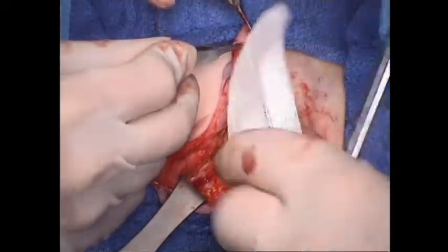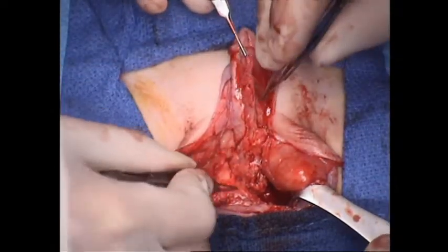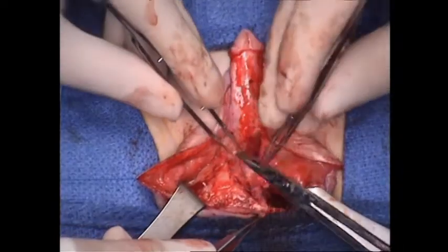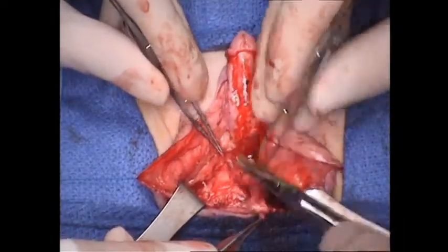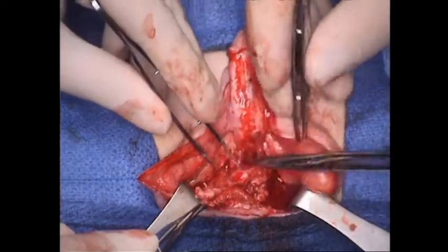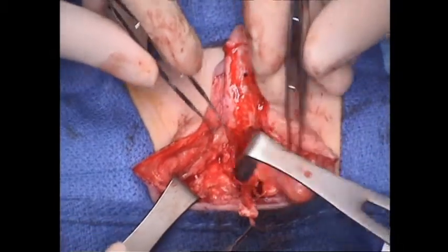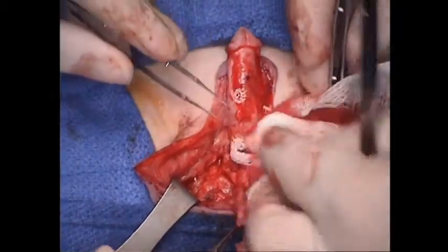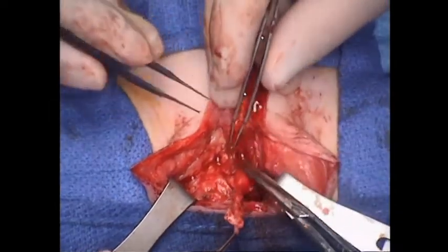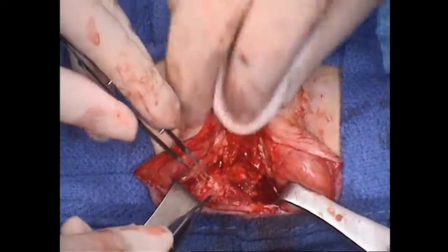There's more mobility. We've got at least a centimeter more flexibility on this native urethra to stretch and cover one or two, or if we get lucky, even all three of our corporotomies that we'll be making in just a second. But we wanted to go ahead and do this dissection first, and it's important to do these steps in the correct order, because once we've made those corporotomies, then your assistant loses a hand because they're holding pressure over the corporotomy sites instead of being able to help with this dissection.